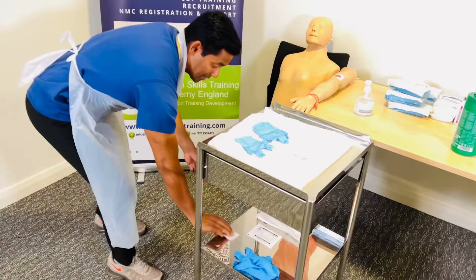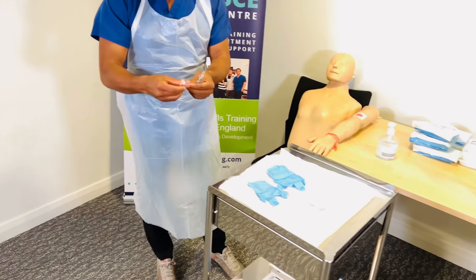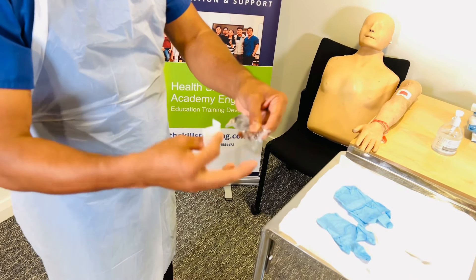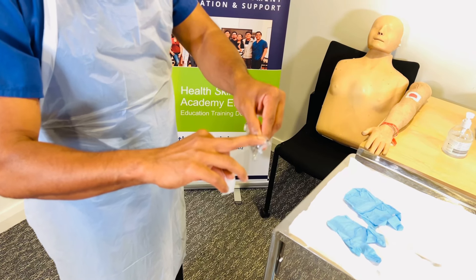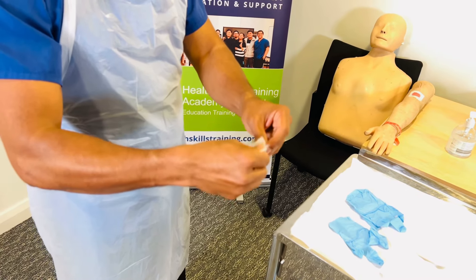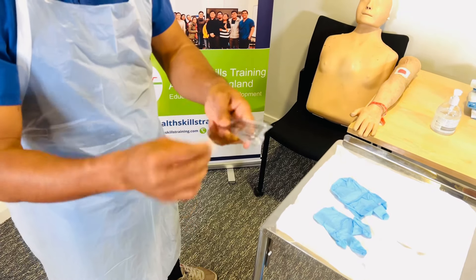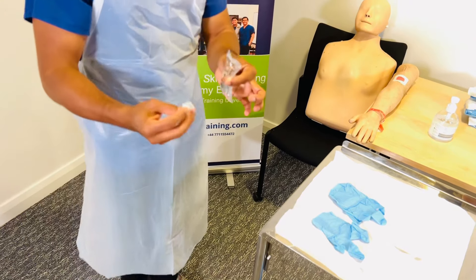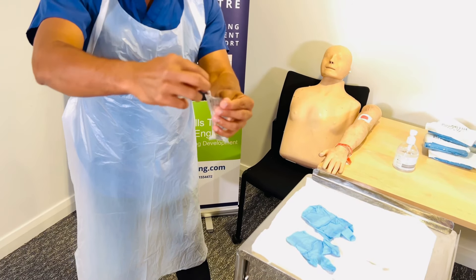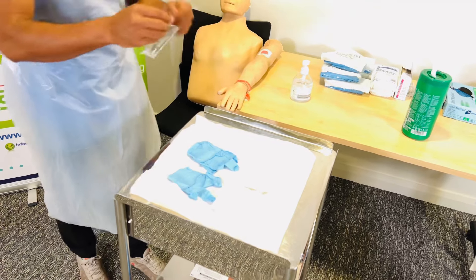Next, clean the saline sachet. You don't need to clean your hands again as you're touching the outside. Open the alcohol or chlorhexidine wipe — there is a black dot on the saline sachet indicating where you will tear it. Clean that end, verbalizing that you are cleaning for 30 seconds and drying for 30 seconds. You don't need to actually wait; just verbalize it. Then tear at the black dot and pour directly into the gully pot — ensuring your hands or sachet do not touch the aseptic field.